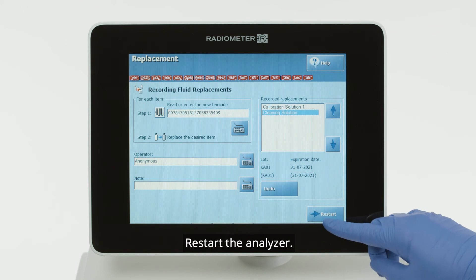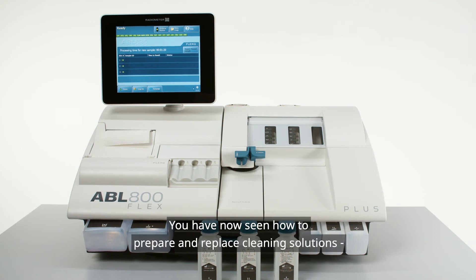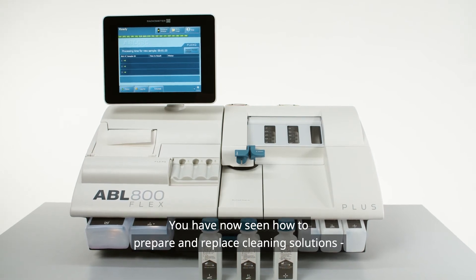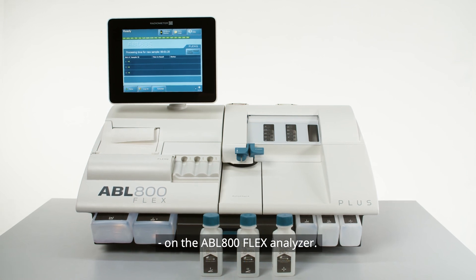Restart the analyzer. You have now seen how to prepare and replace cleaning solutions on the ABL 800 analyzer.